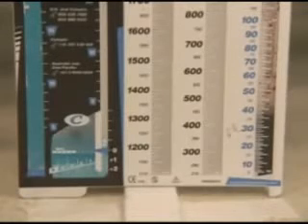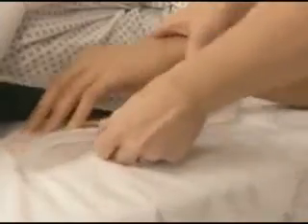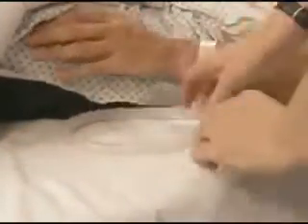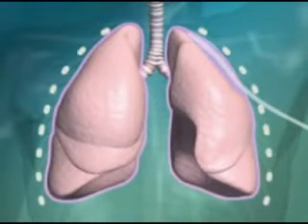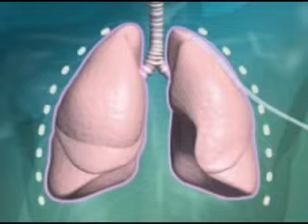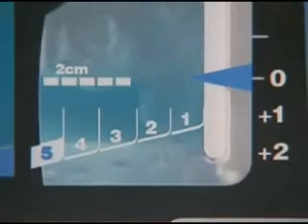The absence of tidaling commonly indicates an obstruction, which can occur when the tubing is kinked, compressed, or clogged, or has a dependent loop. Absence of tidaling can also occur when the lung is reinflated because the negative pressure in the pleural space is restored. Also look for bubbling in the water seal chamber.